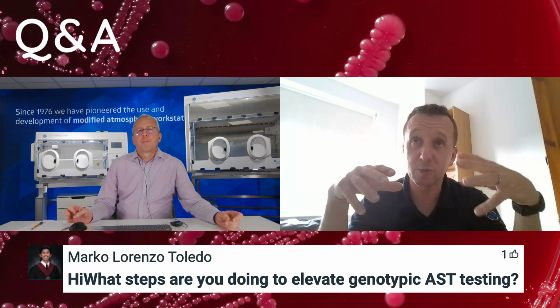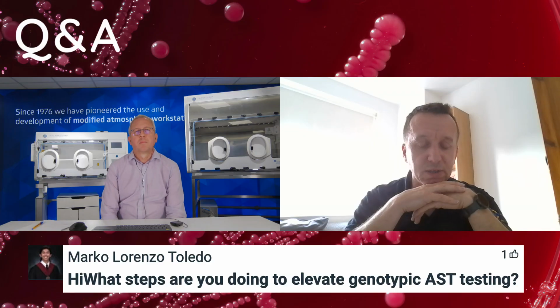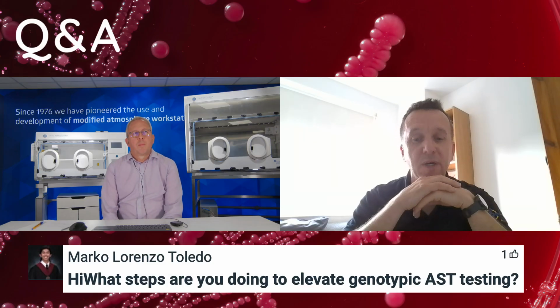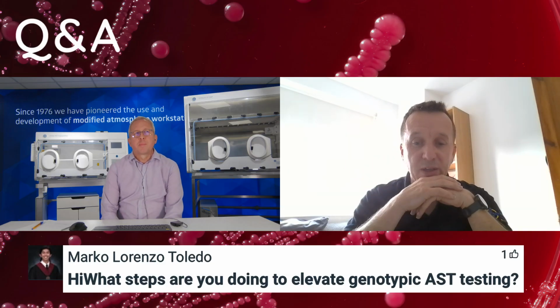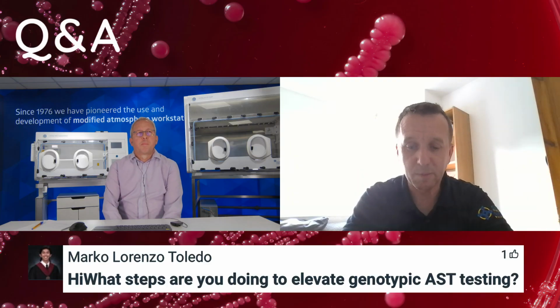We're not performing whole genome sequencing on everything, but anything of interest, if we are phenotypically resistant or unusual, we're performing whole genome sequencing on, and then we're feeding that information back to inform the UCAST team, and then as we gather that data, we'll be able to make better decisions in terms of whether there is an opportunity to use WGS as a substitute for phenotypic AST in the future.